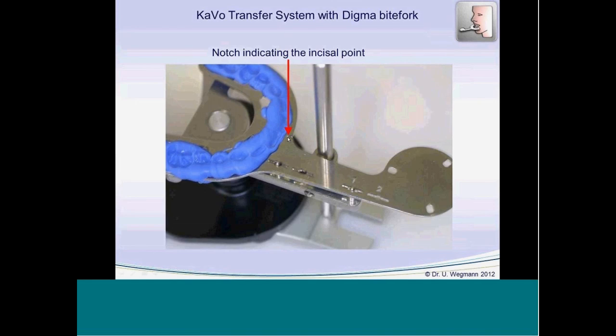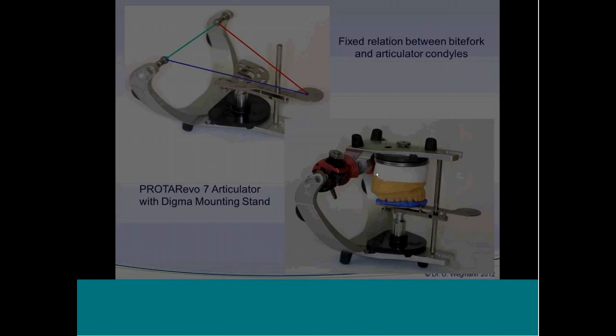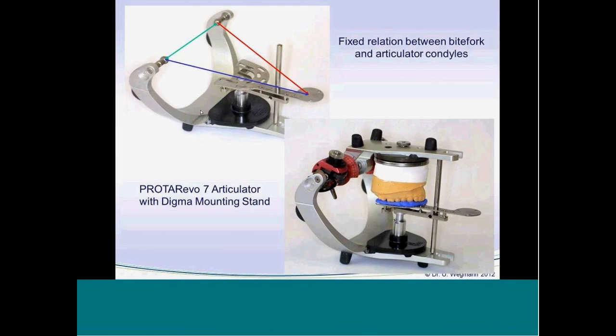When you have done this impression and the first measurement with the Digma system, the lower bow will be attached here, then you can transfer this bite fork to a mounting stand in the lower part of the articulator. And with this, you have always the same position of the bite fork in your articulator, and this position is known to the Digma. The distance from the registration system to the artificial joints is always the same, and that makes it very simple to do the mounting of the upper model and, of course, to do the calculating of the settings for the articulator joints.